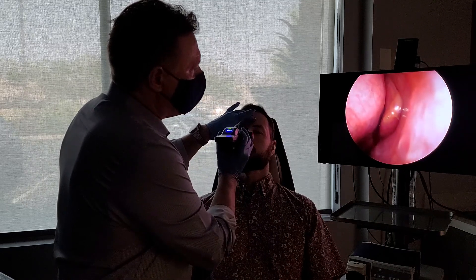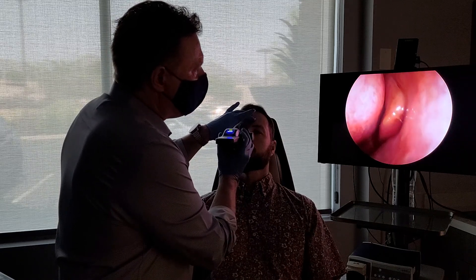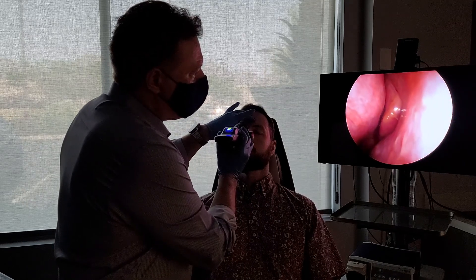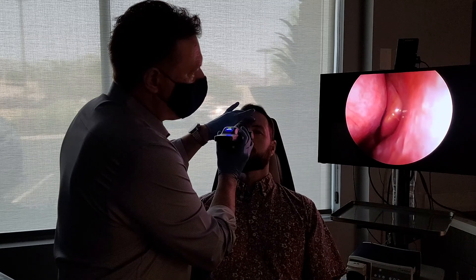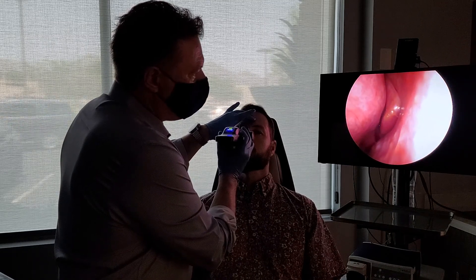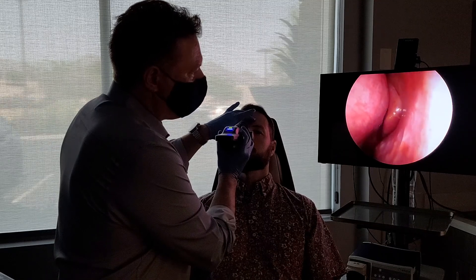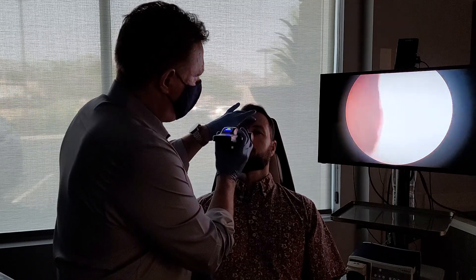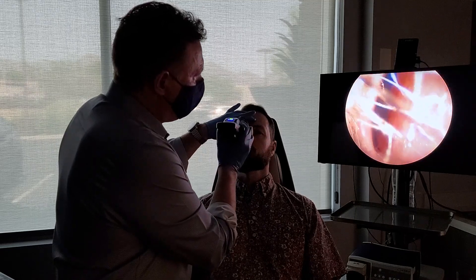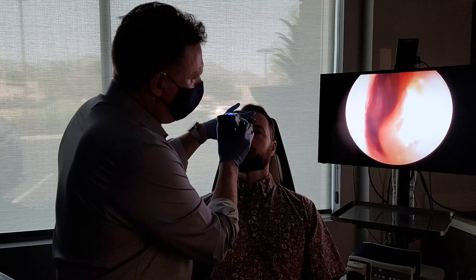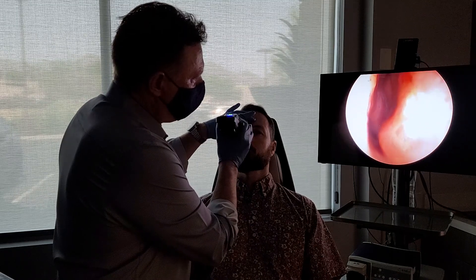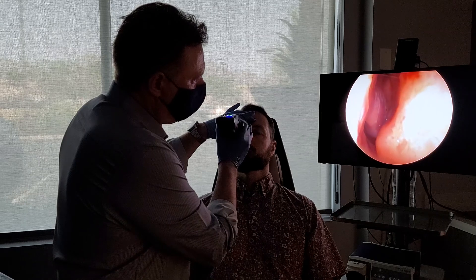Kevin's middle turbinate is lateralized, meaning that it's shifted off to the outside of his nose, which blocks the breathing pathways but also blocks the sinus drainage pathways from the sinuses above the eyes, in his cheeks, between his eyes, and behind his eyes. Now on the nasal cavity on this side, we can see the septum. Inferiorly, Kevin has a little bit of a septal spur — a deviation that shifts off to the front part of the nose — that blocks the breathing pathway.